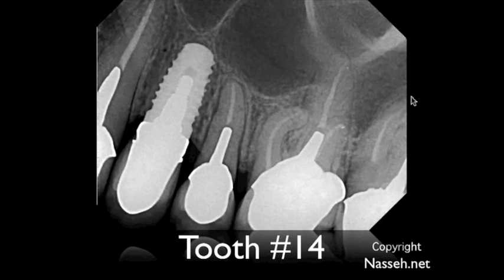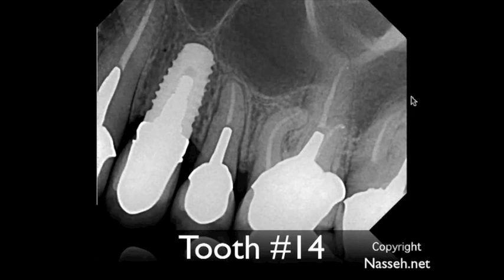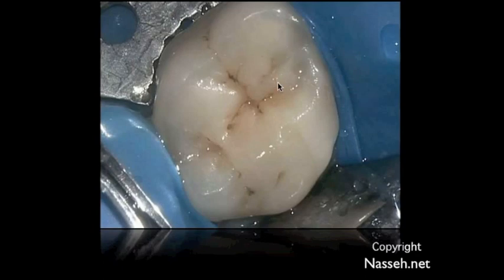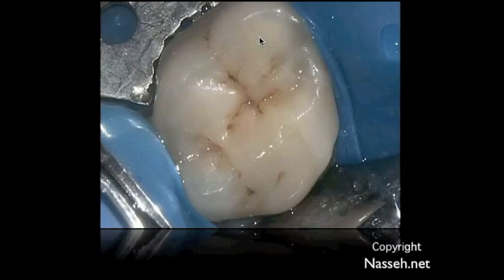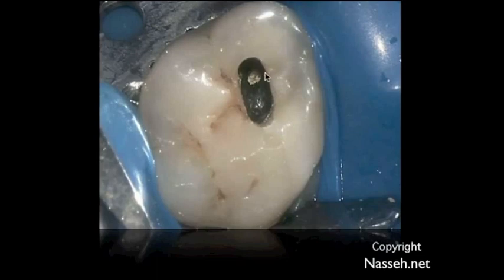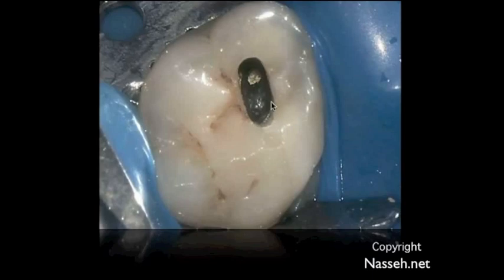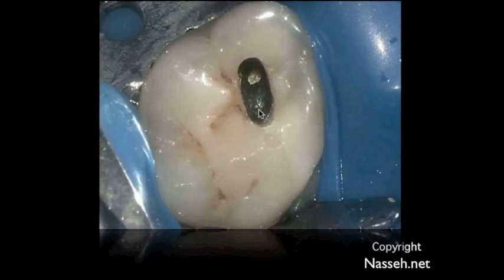Since the crown was relatively recent and the patient was not interested in having the crown redone, we decided to do a very conservative approach microscopically — essentially preparing a very tiny opening over the mesio-buccal root and through that opening search for the MB2 canal. This is really only possible using microsurgical techniques and a microscope. A very conservative, almost oval-shaped preparation outline form, similar to what you would prepare on a maxillary canine or premolar, was performed through the crown over this tooth.